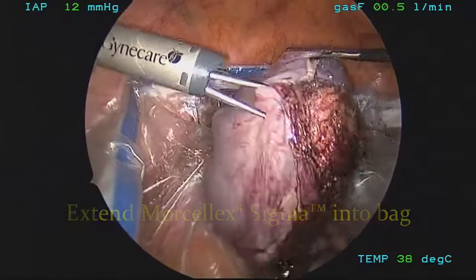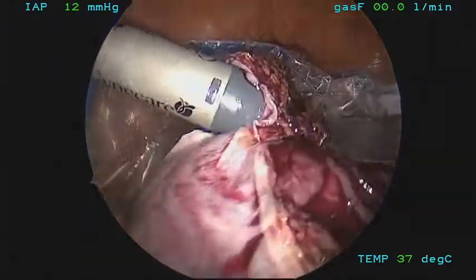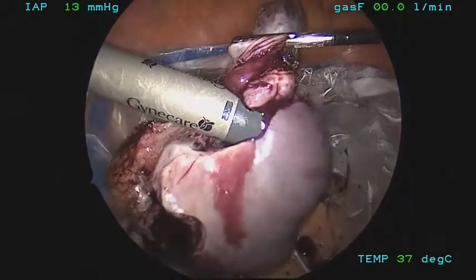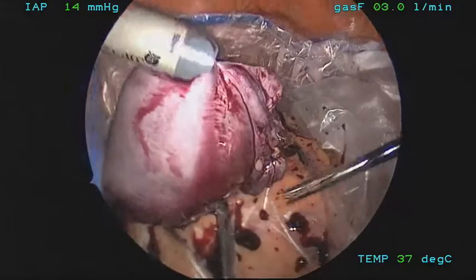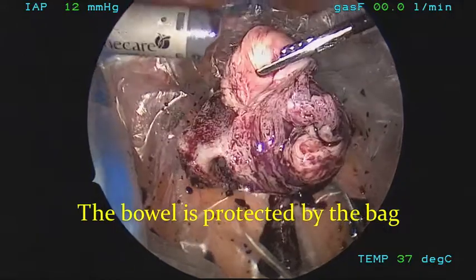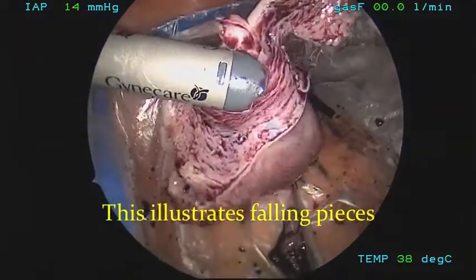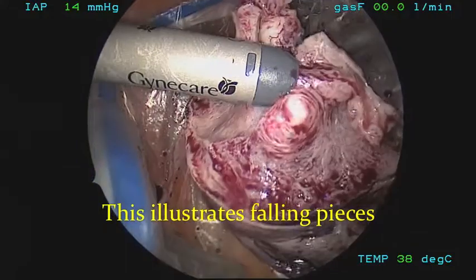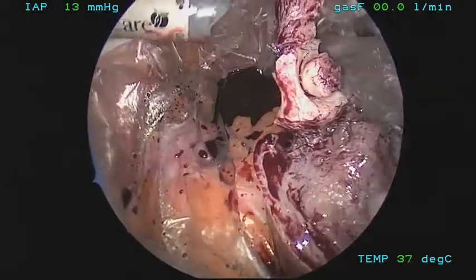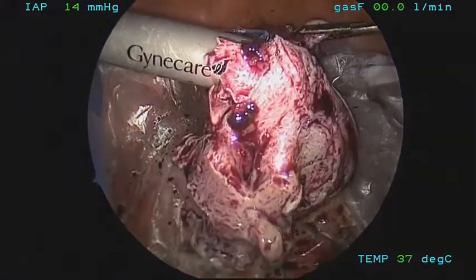Now with careful morcellation, the morcellator is brought over and into the bag. The bowel is nicely protected as well as the omentum. It's important that the assistant grab and grasp the uterus to keep it from moving during the morcellation process. If the uterus is allowed to spin freely, tissue could be shot into the upper abdominal cavity. Now you can see careful, slow morcellation occurring with control of the tissue. The tissue falls into the bag, and small bites are taken. As you can see in this video, 360 degrees I can see around my morcellator tip so that I will not pick up any bowel.